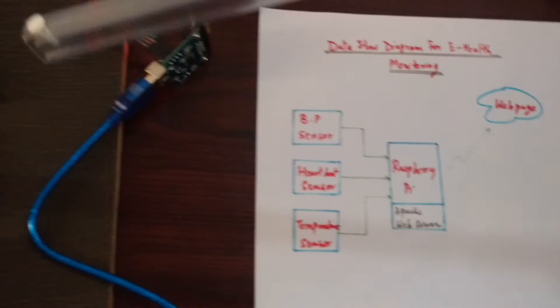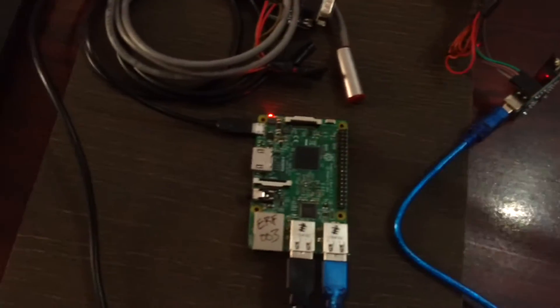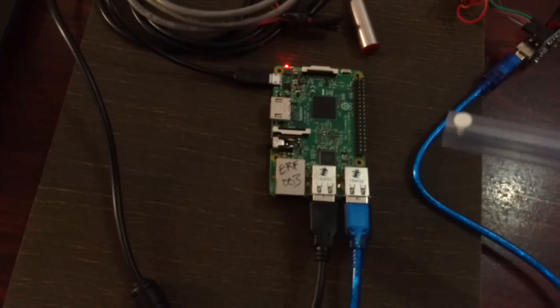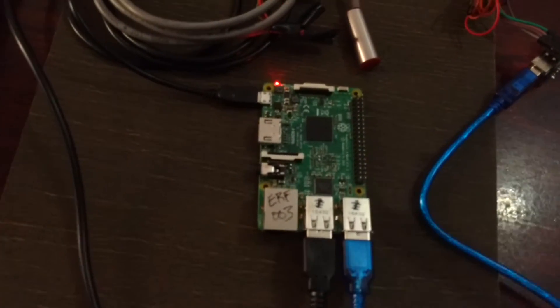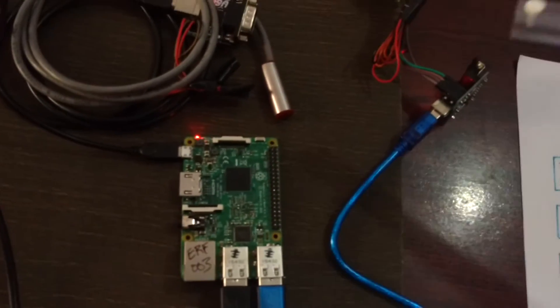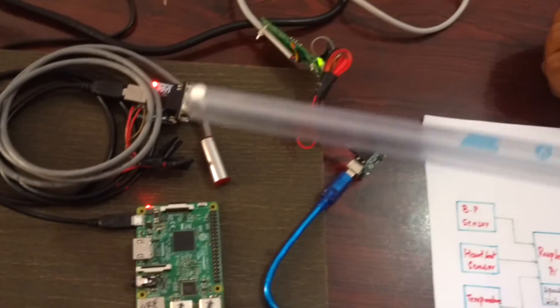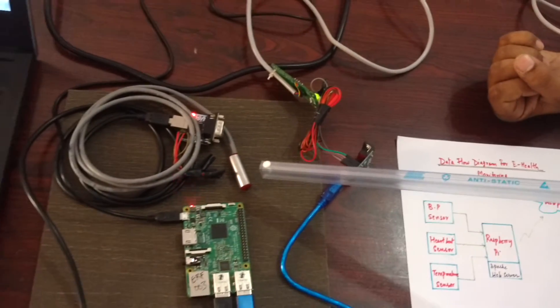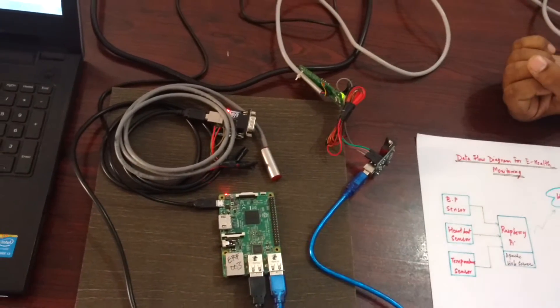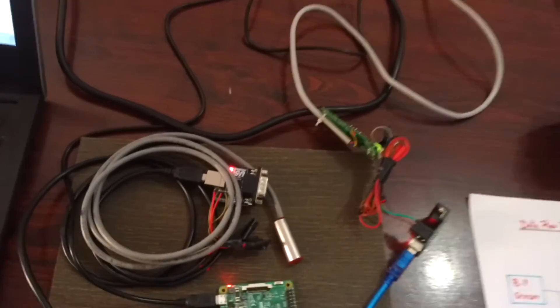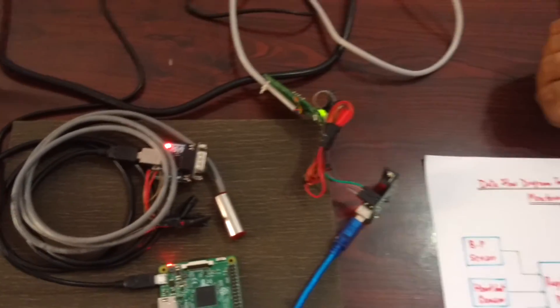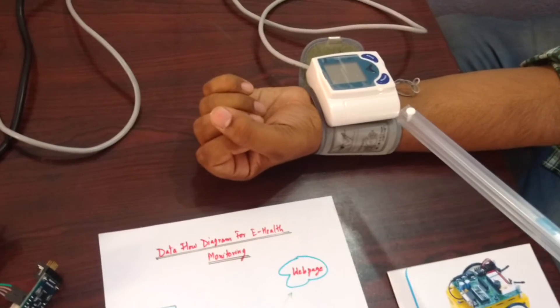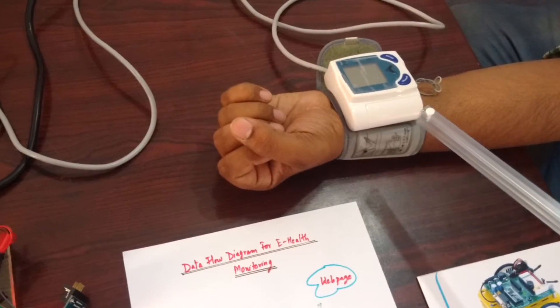Here we have the hardware. This is a central controller which is Raspberry Pi and it is connected to these three sensors: a temperature sensor and a blood pressure monitoring sensor which also gives us the heartbeat value.